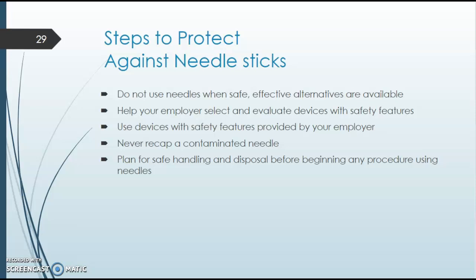Plan for safe handling and disposal before beginning any procedure, meaning have your sharps container ready and nearby. And if you're using a needle without a safety device, be extra careful that that sharps container is the first step you go towards.